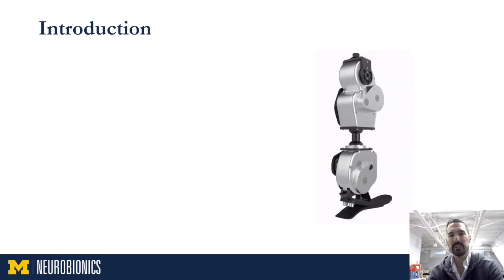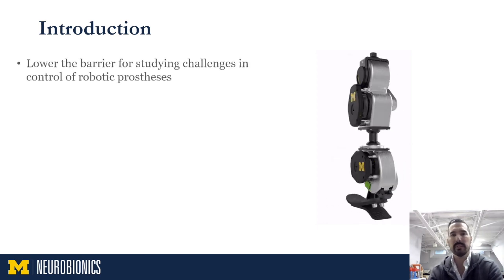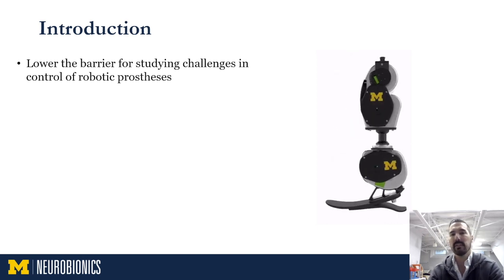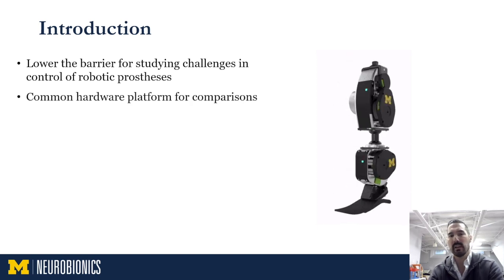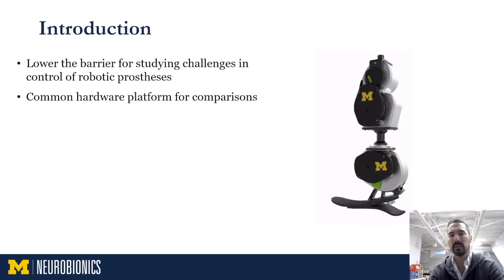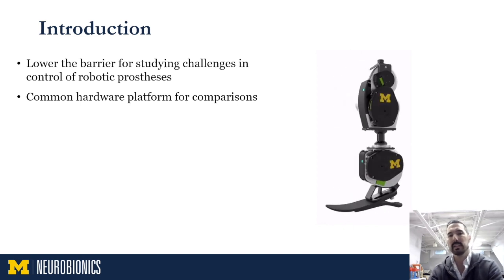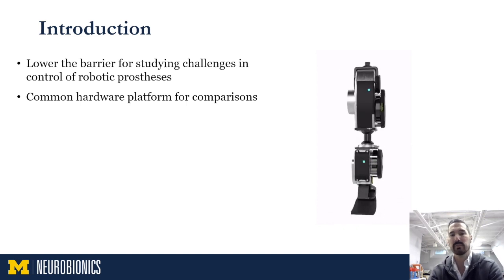I'd like to begin by sharing a little bit about the motivation for the open source leg project, the goal of which is really to lower the barrier for studying some of the control challenges that have hindered the widespread clinical adoption of these systems. Our idea is to create a common hardware platform that facilitates comparison of different control strategies from different research groups around the world, and also to lower the time and financial burden associated with the continual redevelopment of robotic legs before studying different control strategies.